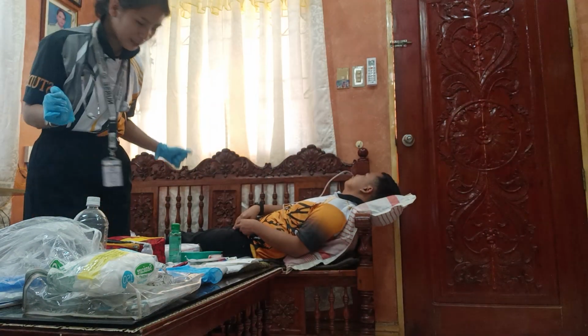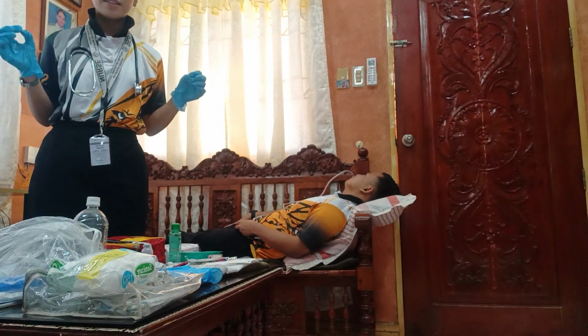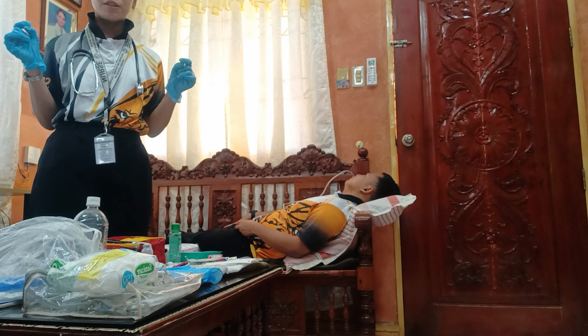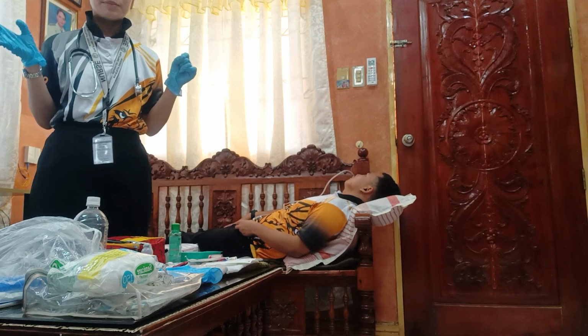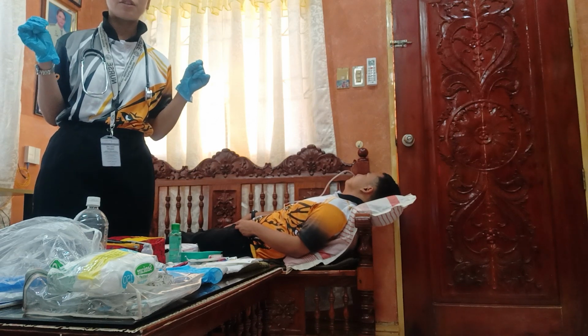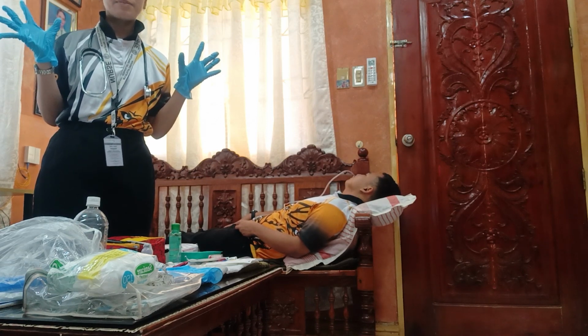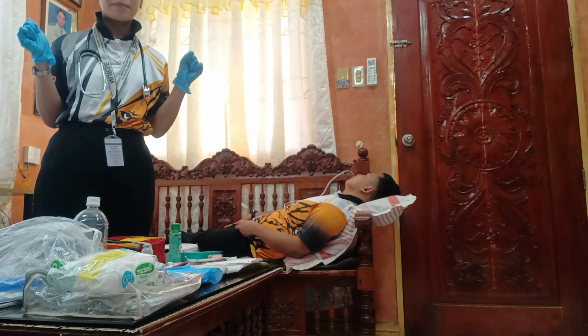And after po niyan is, I will attach the syringe to the end of the tube and aspirate a small amount of the stomach contents po. The tube is in the stomach if the contents can be aspirated. The pH of the aspirate can then be tested to determine gastric placement.